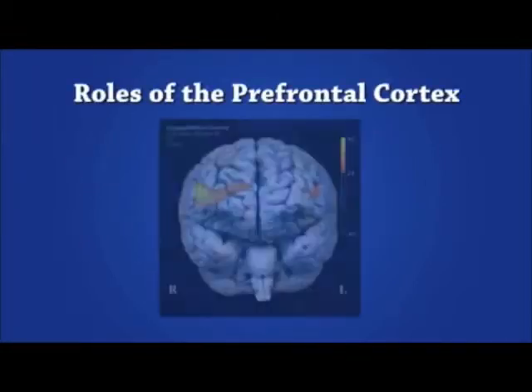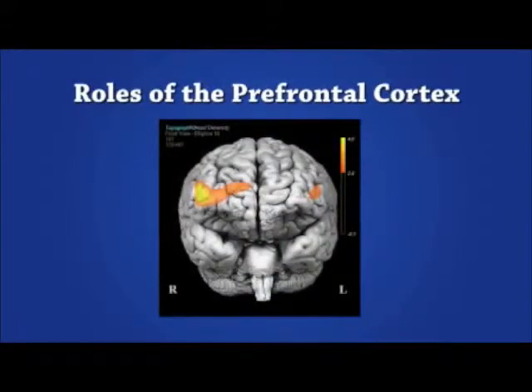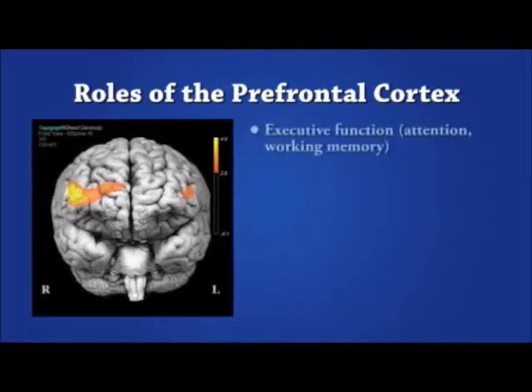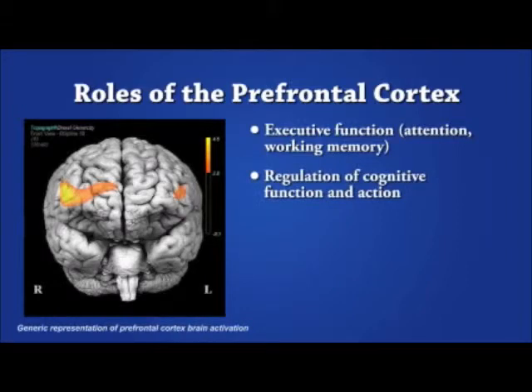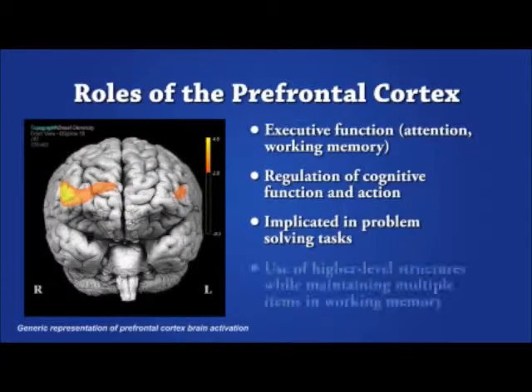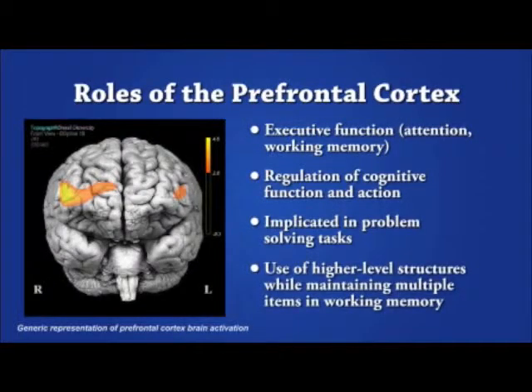Using FNIR and focusing on the prefrontal cortex, we are capitalizing on the function of the PFC, especially executive function, the regulation of cognitive function and action, the use of PFC during problem-solving tasks, and the use of higher-level structures while maintaining multiple items in working memory.